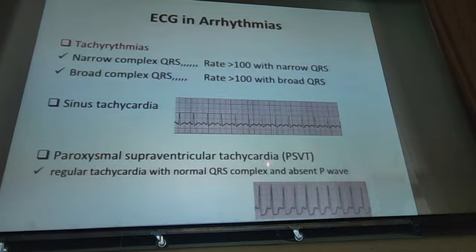Supraventricular tachycardia, or paroxysmal supraventricular tachycardia. It is mostly paroxysmal, not continuous, and it is not dangerous, mostly. The whole episode is spontaneously developed and spontaneously will be resolved. You may go to study it better, and the whole chapter better.